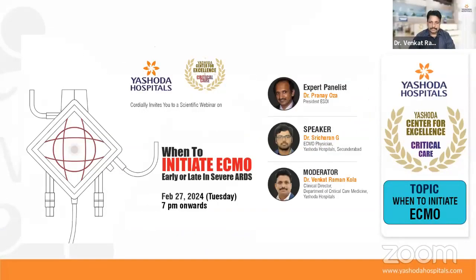Okay. So to speak about the preface of the topic, we want to discuss the optimal timing of initiating a patient on venovenous ECMO who has severe ARDS. As we all know, there are certain therapies, such as mechanical ventilation strategies or recruitment maneuvers, especially proning, which can be done prior to initiation of ECMO, and then comes the actual initiation of ECMO and managing a patient on VV ECMO. However, when does conventional ventilation stop, and when does ECMO management or initiation start? This line has been quite blurry.